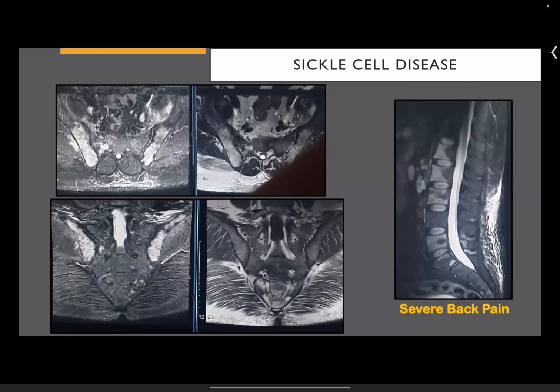You have to take it case to case. Whether edema enhances or not, in my experience, most of the time it enhances. I give contrast in tumors to help see the extent of the tumor, but more importantly, to see which area is viable tumor, which I need to biopsy, which will give me the diagnosis, and whether there's any area of necrosis which I need to avoid putting a needle in. I think that's a much more important use of contrast rather than just seeing how far it goes.